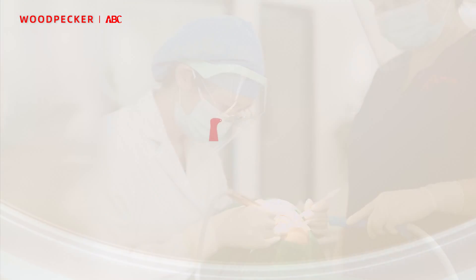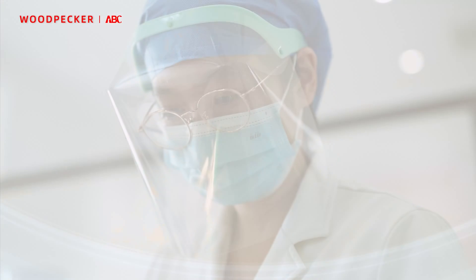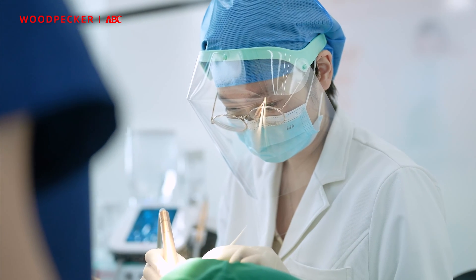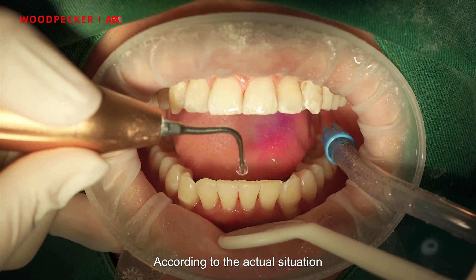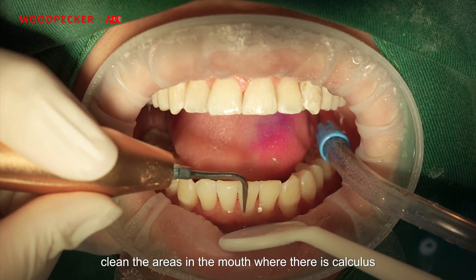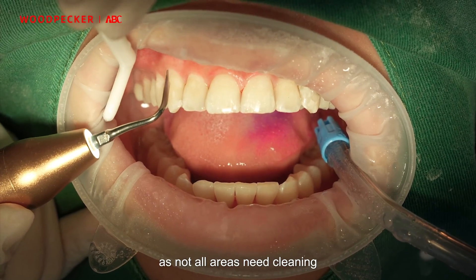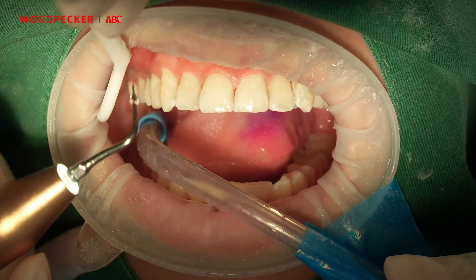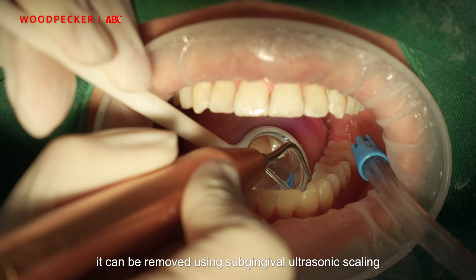Step 5: Subgingival Ultrasonic Scaling. According to the actual situation, clean the areas in the mouth where there is calculus, as not all areas need cleaning. If the patient has subgingival calculus, it can be removed using subgingival ultrasonic scaling.